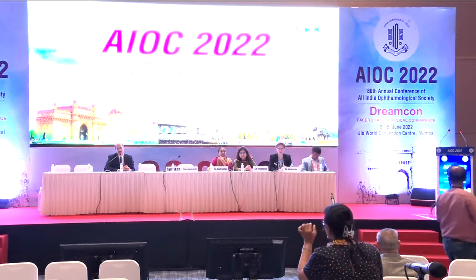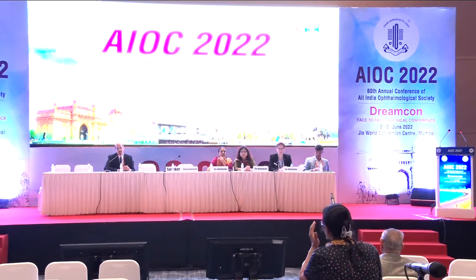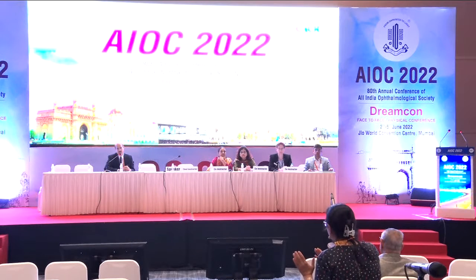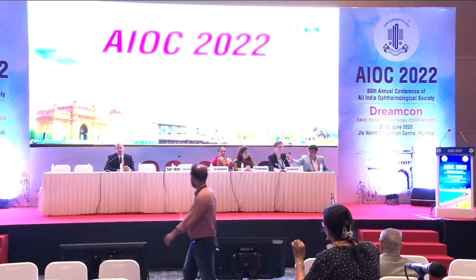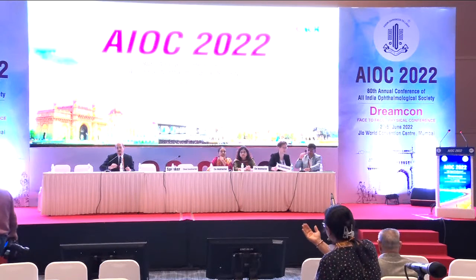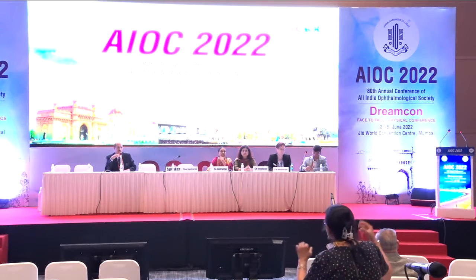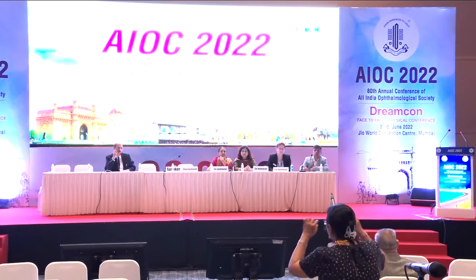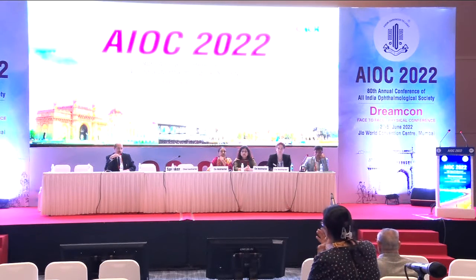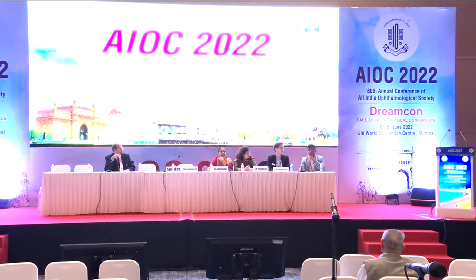Now the cluster defect, that is the central point of the discussion. In the definition of cluster based on 24-2, the clusters are defined with symmetrical identical points in upper hemifield and lower hemifield. But in 24-2C, the points are imported from 10-2 and they are asymmetrical points. So how that comparison will be there? Manish, would you like to address the issue?